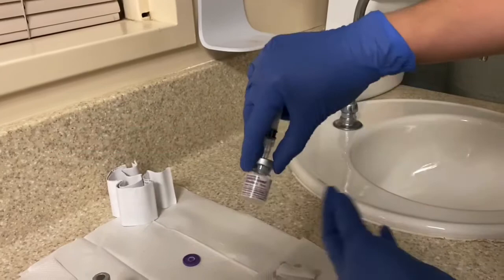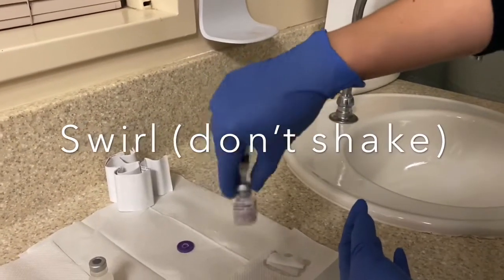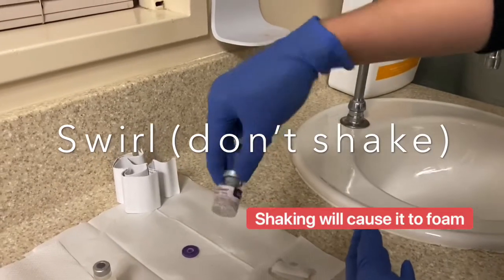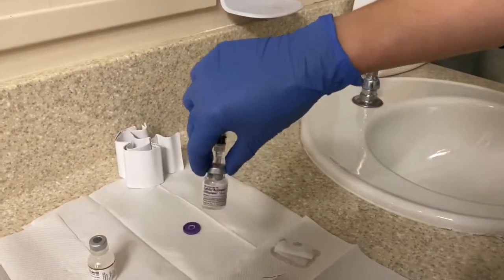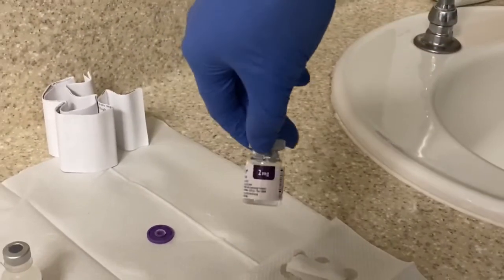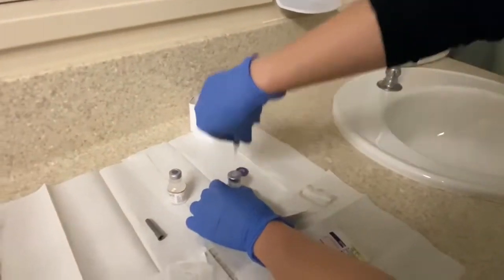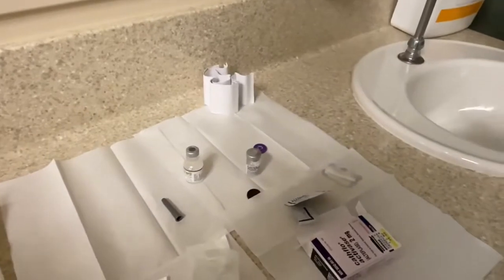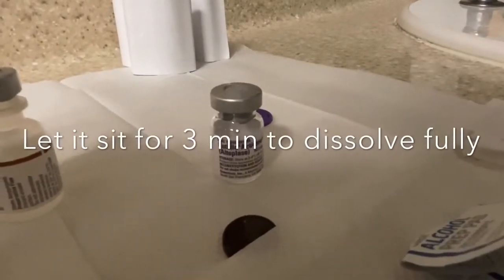After inserting, go ahead and mix it — make sure you don't shake it. You can remove the syringe for easier swirling. Swirl, don't shake — shaking is going to cause it to foam. The finished product is 2.2 ml and it will be at a concentration of 1 mg of cathflow to 1 ml solution. Let it sit for 3 minutes to dissolve fully.